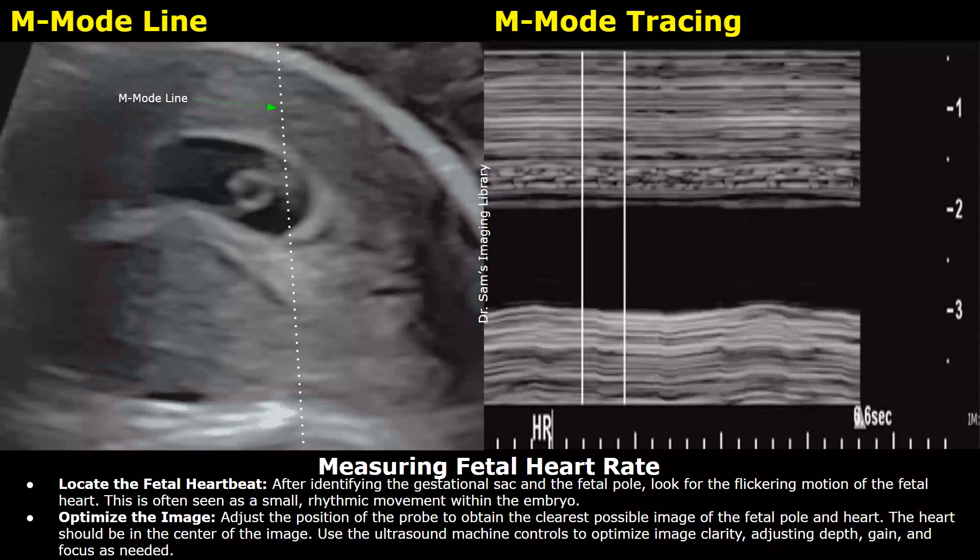Then you can measure the fetal heart rate. The heart rate is measured using the M-mode function. First, locate the fetal heartbeat — it will appear as a flickering motion within the embryo, a continuous rhythmic movement. Try to obtain a clear image of the embryo and its heart, placing the heart at the center of the image by adjusting the probe and optimizing the image by setting the depth, gain, and focus as needed.